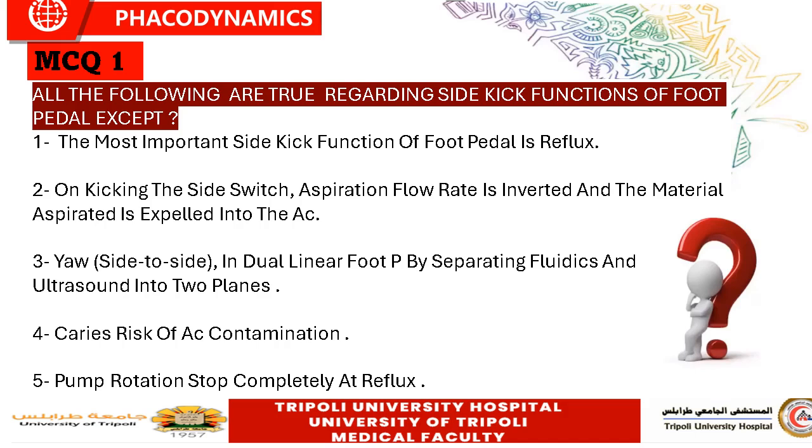The side kick function is to reverse the direction of the pump, so that any structure inadvertently caught by the Phaco tip is released. So if by mistake you catch the iris, you can reverse the direction of the pump to release this iris by the side kick function of the foot pedal.